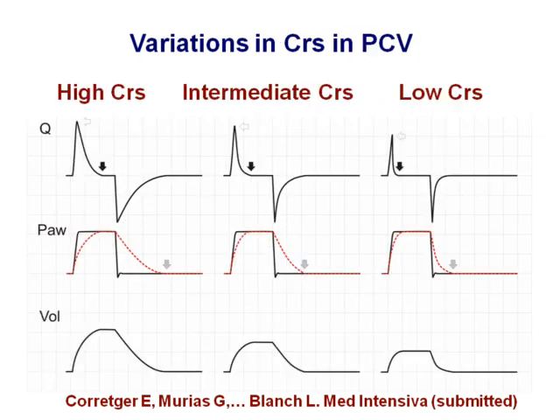But also we are dealing with pressure-limited modes at the bedside, and there is no difference in terms of outcome in volume control and pressure control. And again, if we want to ventilate in pressure control, choosing an inspiratory time, if the compliance changes, the delivery of the tidal volume is going to be affected, and then what we will see is this typical flow pattern where there is also a big pause, because since the system is not elastic in this way, the distensibility of the alveoli is very low, so we get the pressure immediately, and the result is a low tidal volume.